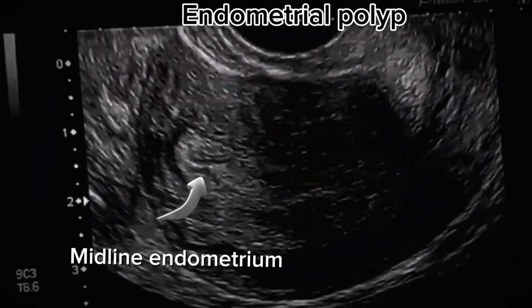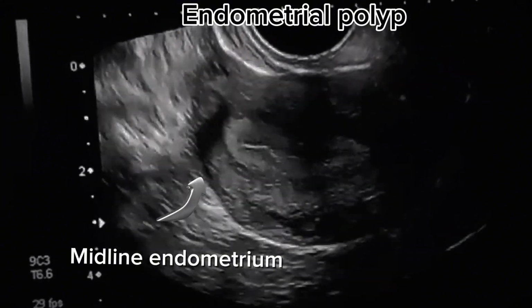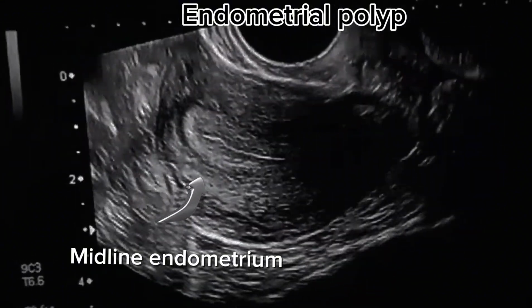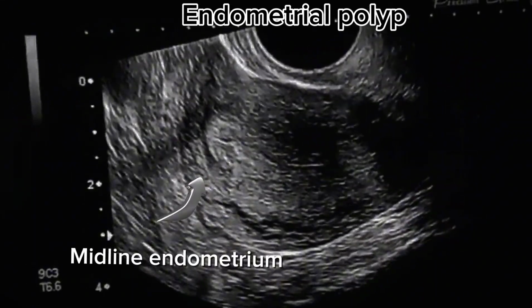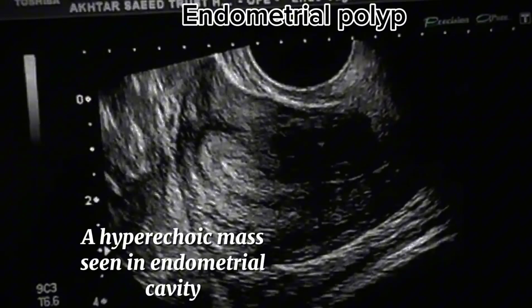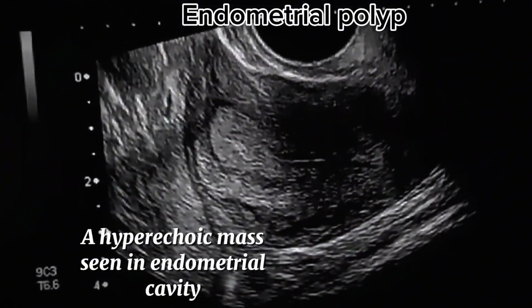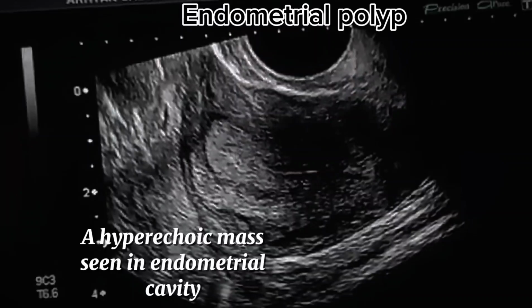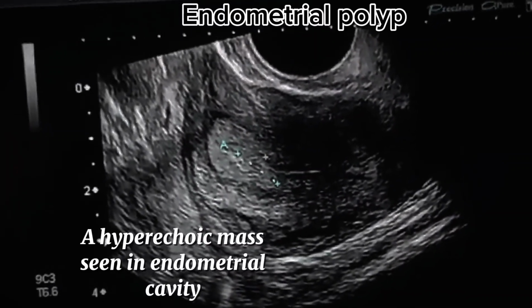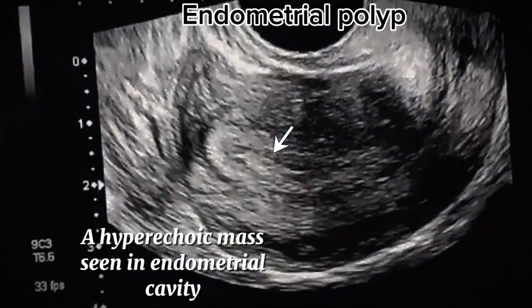The patient had a history of infertility, while as we can see, normal anteverted uterus is seen with midline endometrial echoes. A small hyperechoic mass is seen in the endometrial cavity lying near the fundal region. Diffuse thickening at this site of endometrium can be noted. Rest of the endometrium and cervical canal appear to be normal.